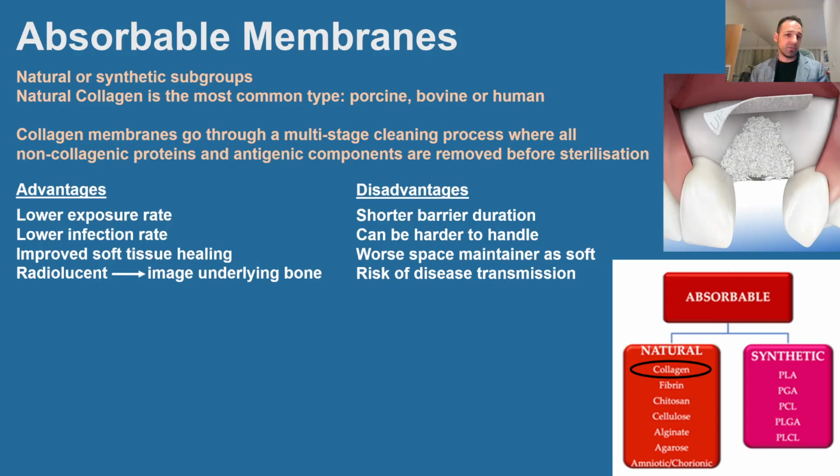Disadvantages of absorbable membranes. So we've got shorter barrier duration. As you can imagine, titanium meshes or PTFE, they do not dissolve, so you need to do a second stage surgery to remove them, but they last longer. These absorbable membranes are dissolved away by the body's enzymes, and therefore it's a shorter barrier function, meaning less bone will form usually.